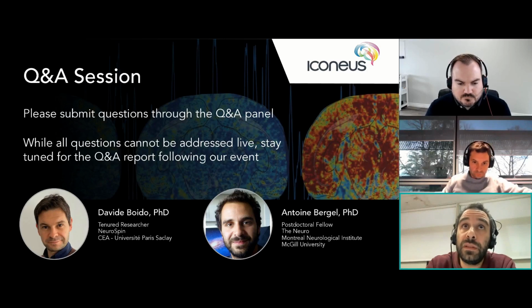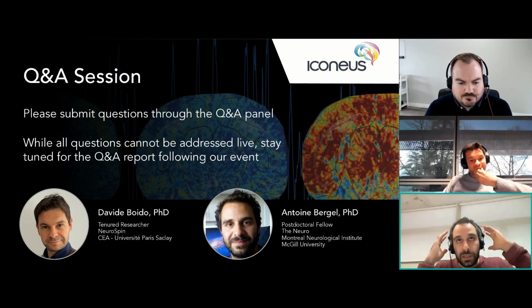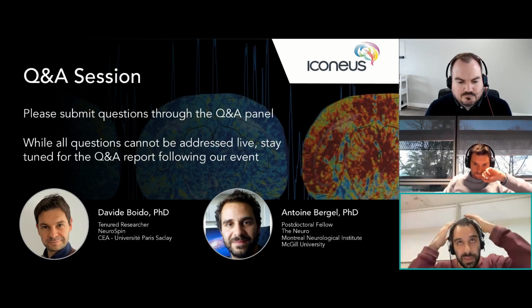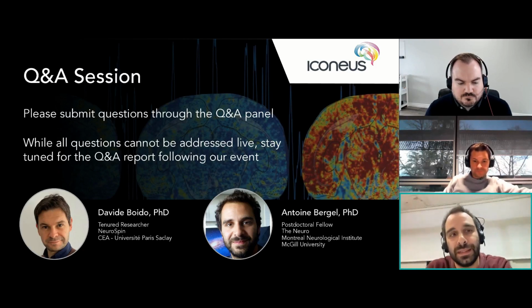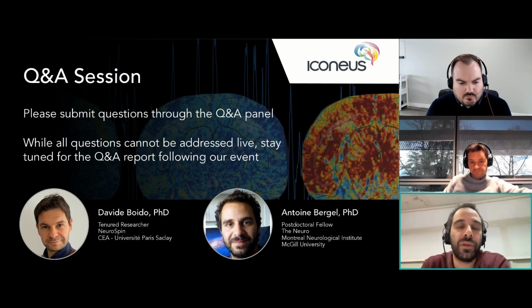We are not the only ones doing this kind of craniotomy. Maybe we do definitely bigger ones, but we are not the only ones to do this, and it's been investigated elsewhere. So I would not be too worried, but it's important to keep in mind. You also have the visual inspection, and sometimes you see that the brain is starting regrowth of different tissue, and you have something akin to skull that's developing beneath the implant. So yeah, that more or less sums up the issues with craniotomy, I think.